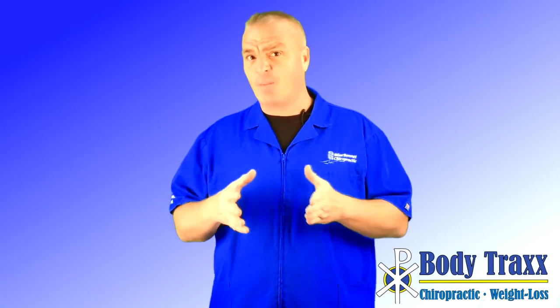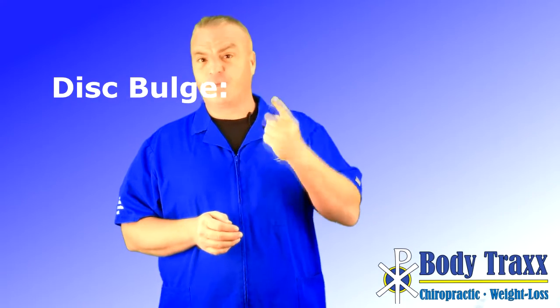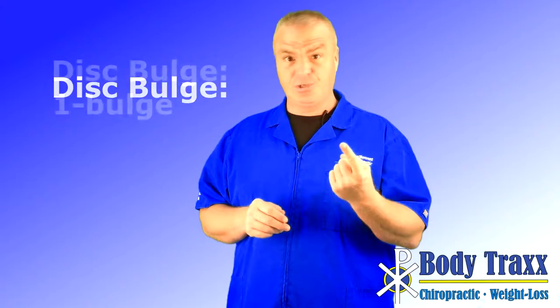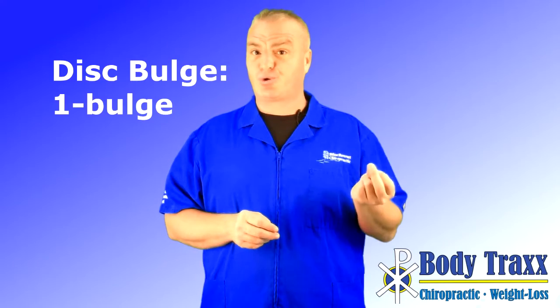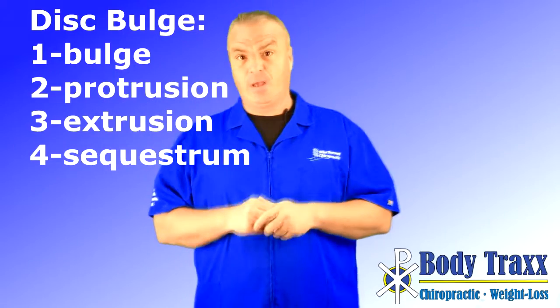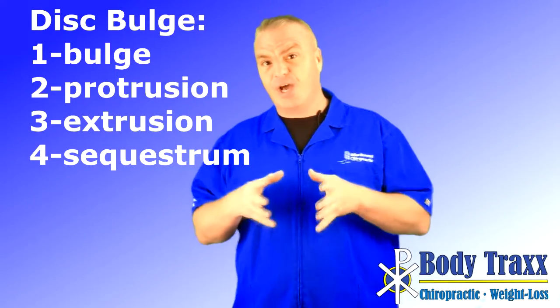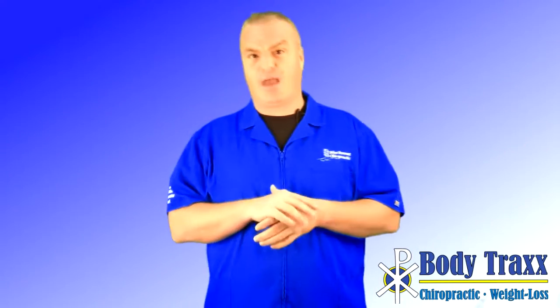All right, so if you went for your MRI for low back pain, the impressions page is going to tell me what they think is causing the pain that you're having. And they're going to classify a disc bulge in 4 different ways. The first way is, of course, just a bulge. It'll say bulge. The second way is going to be through a word called a protrusion. The next one is an extrusion. And finally, the sequestrum. With that information, I can judge where you're at and how much care that you're probably going to need. Now I want to show you how that works, and I'm going to use some very simple animations to show you how this works.